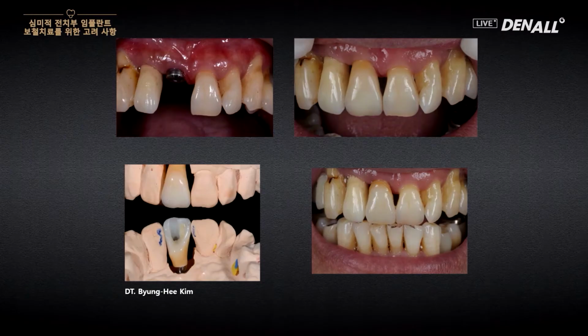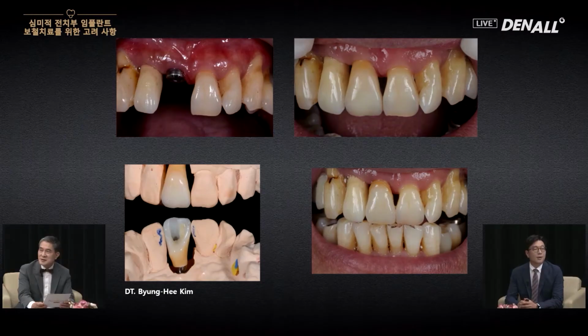The first question, how do we restore the anterior prosthesis in a patient with severe gingival recession? Not only the shape, big embrasure space can be created. What is the wise way to treat that case? I prepared some slides regarding this question. So this is the question.